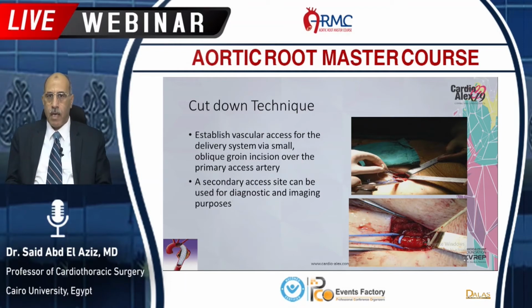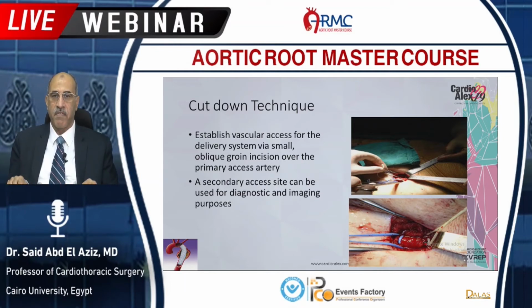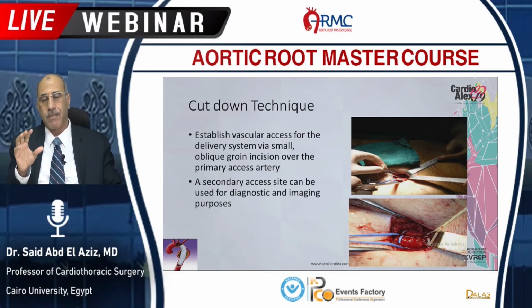To do a TEVAR, we need first to expose the access, which we call cut down on the femoral artery. And all of you as surgeons, you know how to expose the femoral artery, and as I told you, it should be not less than 8 millimeter diameter and without calcification.